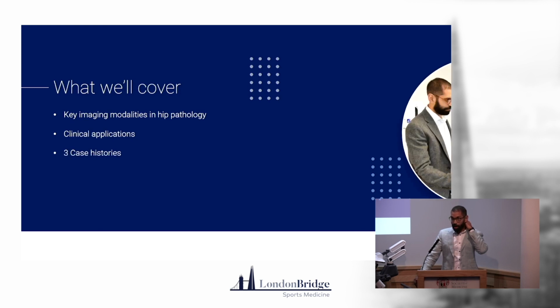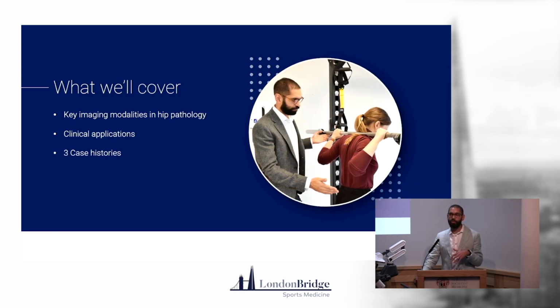I'm going to be talking about hip radiology investigations. I know you've had a chat from Dr. Johnson this morning, which is more about hip and groin, so I'll be touching on a few concepts of that as well, but we'll be much more hip focused with this presentation.